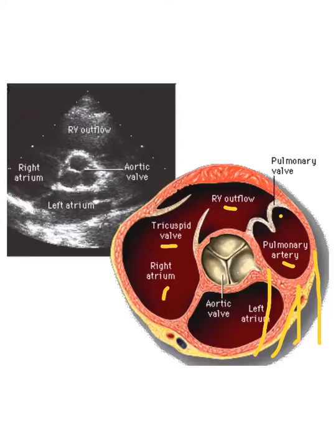So you have the left pulmonary artery and the right pulmonary artery that come off, and this is left, this is right. And they come off the pulmonary artery, and most of the time you want to see those if you can, just to show them. It's a good way of showing them. And then you can see all three leaflets of the aortic valve in this view.